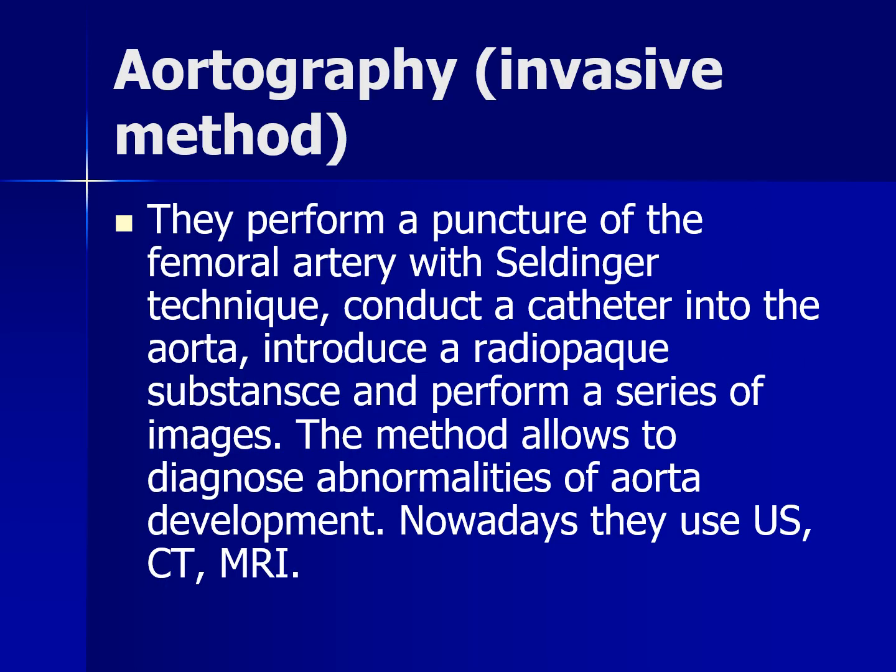Aortography is an invasive method. They perform a puncture of the femoral artery with the Seldinger technique. They also conduct a catheter into the aorta, introduce a radio-opaque substance, and perform a series of images. The method allows us to diagnose abnormalities of aorta development. Nowadays, they use ultrasound, CT, and MRI.